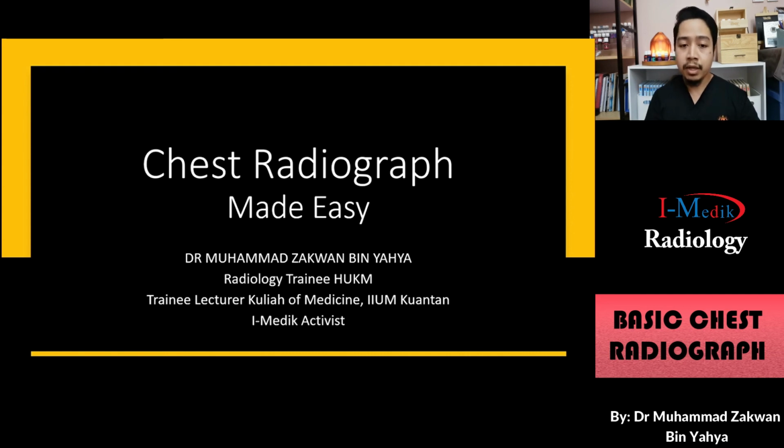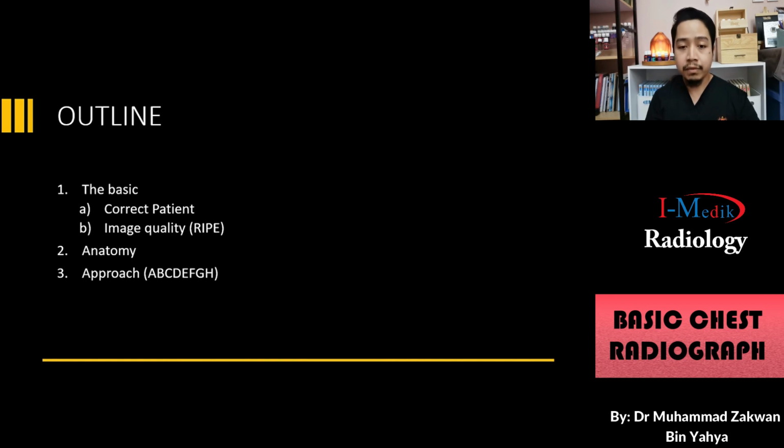This is my outline. The basics regarding the chest radiograph: the first one is the correct patient, and then the image quality of the chest radiograph, and I will talk a little bit about the anatomy of the chest radiograph. Later on, the systematic approach to a chest radiograph.